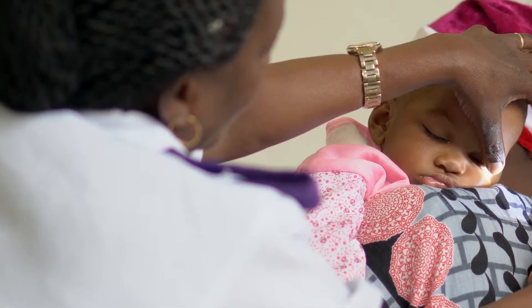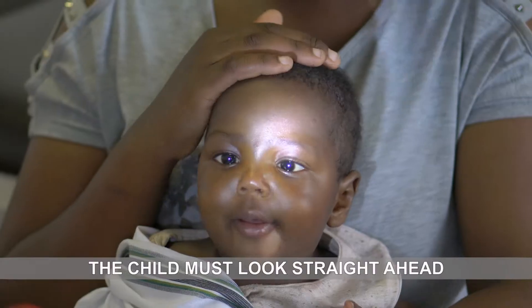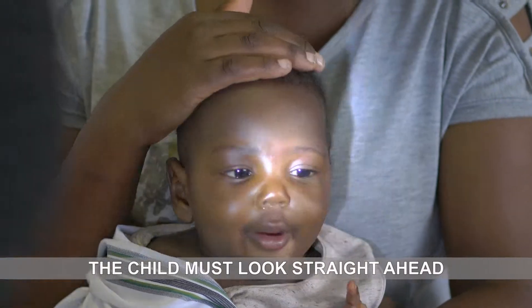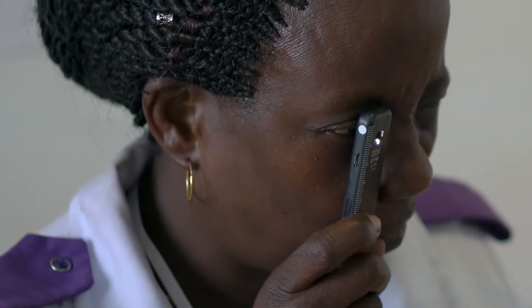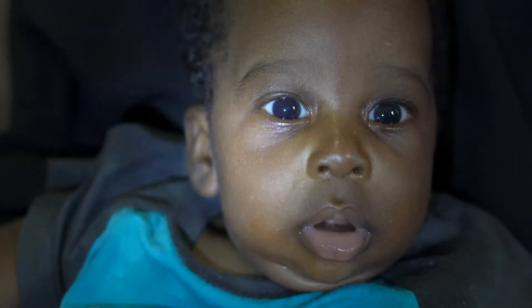Encourage the mother to hold the baby over her shoulder or sitting up so the baby or child is looking straight ahead. Put your eye close to the sight hole of the arc light and shine the light at the baby or child's pupils.